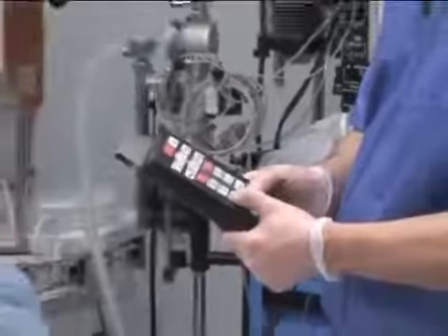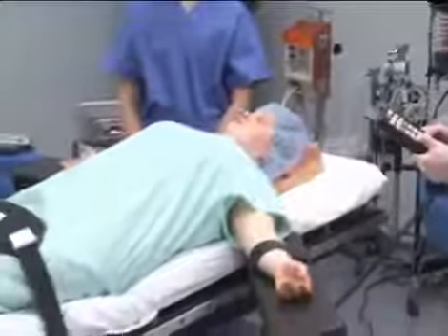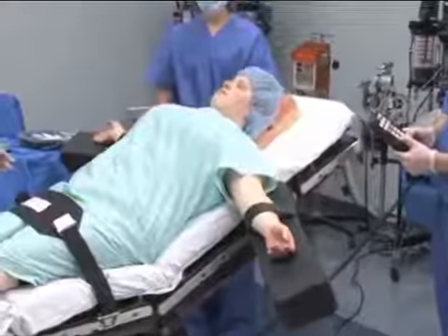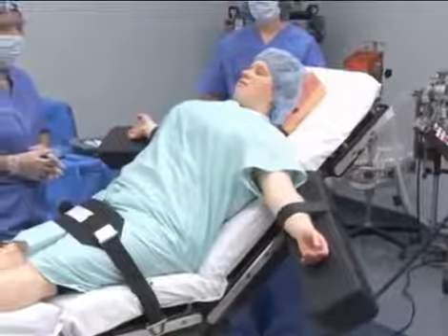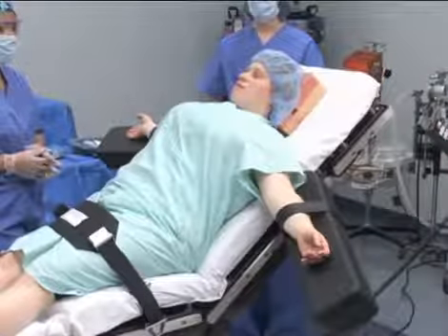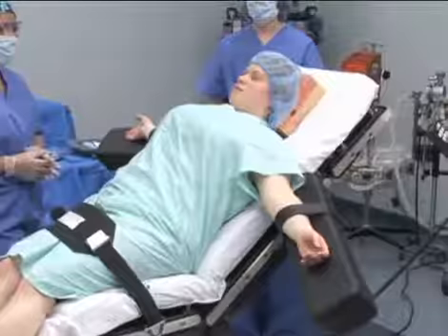The sitting or Fowler position is used for facial, cranial, or reconstructive breast surgery. When this position is used, the general operating table is flexed to allow a Fowler or semi-Fowler position. The head may be secured by a craniotomy headrest or stabilized with a donut-shaped gel or foam pad.